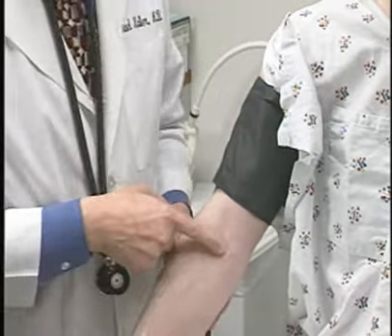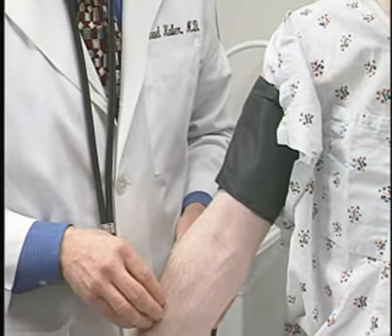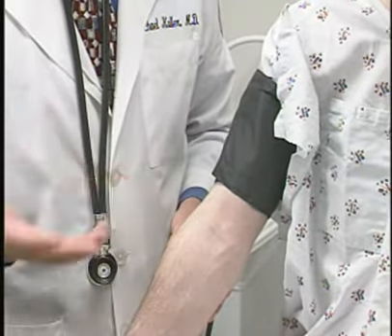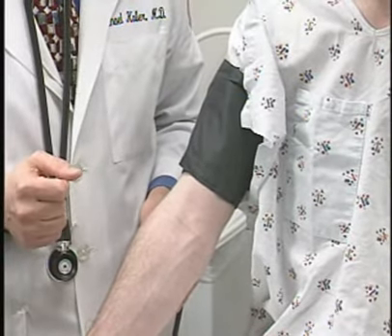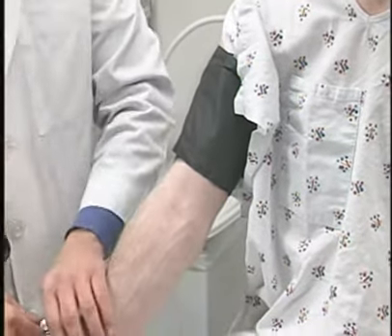Again, the blood pressure must be taken on skin. It shouldn't be taken over an article of clothing or the patient's gown. And the patient should be relaxed and calm. Don't check the blood pressure if the patient just rushed into your office, they're late, or if they're crying, because of course the blood pressure will be elevated. First, we're going to check the blood pressure by palpation.